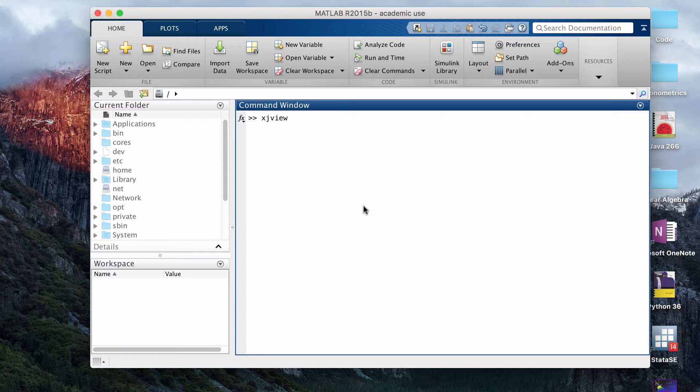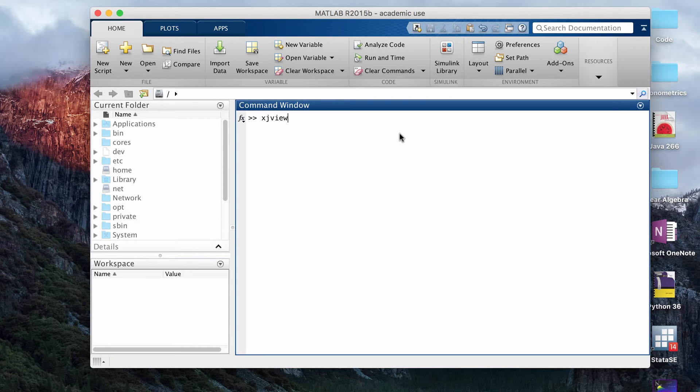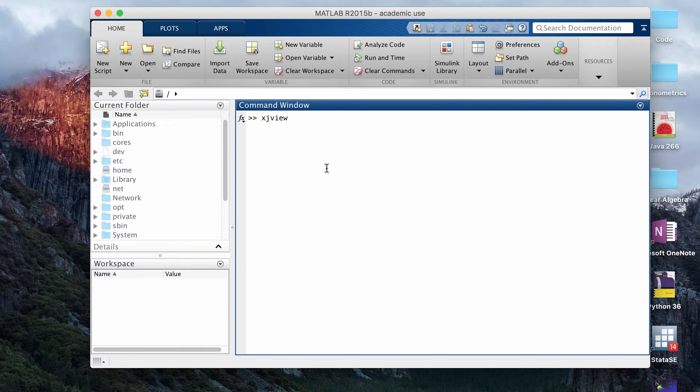It's usually used in conjunction with SPM and actually on its website it says it's usually used for fMRI analysis. I've seen it used for VBM a lot as well. If you download it for free and set it correctly in MATLAB, then you can just type in XJView in the command window and click enter and it should pop up.